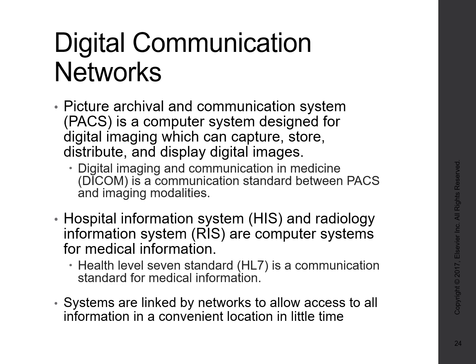Now you can have a surgeon in the operating room looking at it while the physician that's going to be caring for the patient in post-op is looking at it as well. So it just offers a lot of benefits. The other benefit it offers for you guys is previously with film, if you were going to image a patient, you'd have to go to the film room, get all their previous images, and then give the similar images from previous exams with your new image to the radiologist to read.